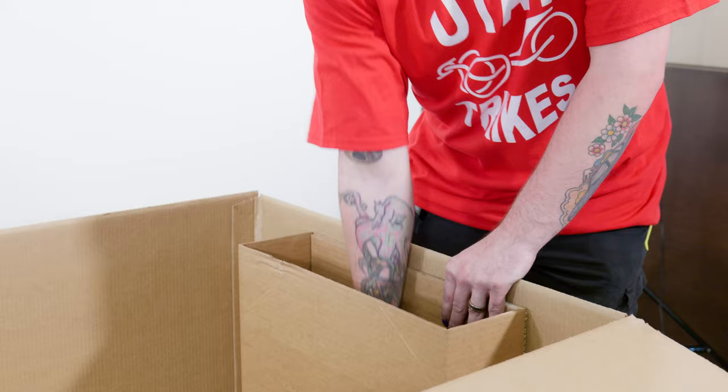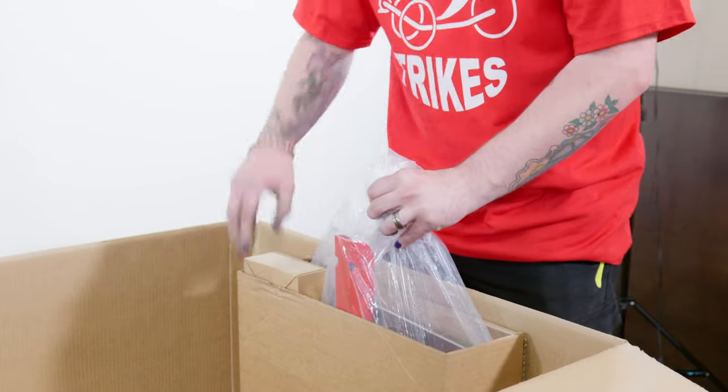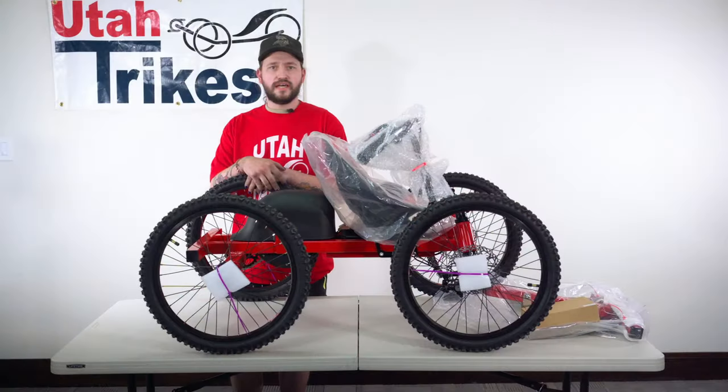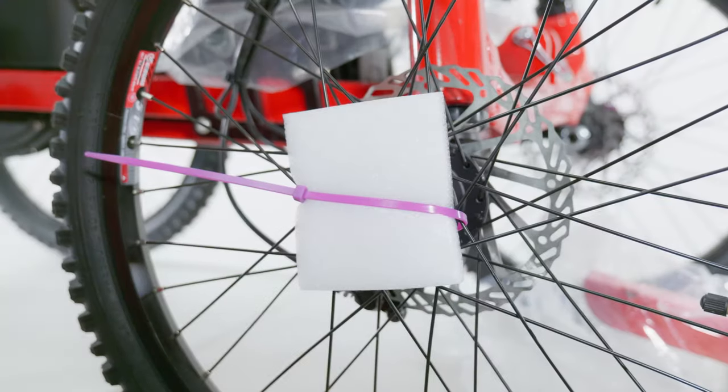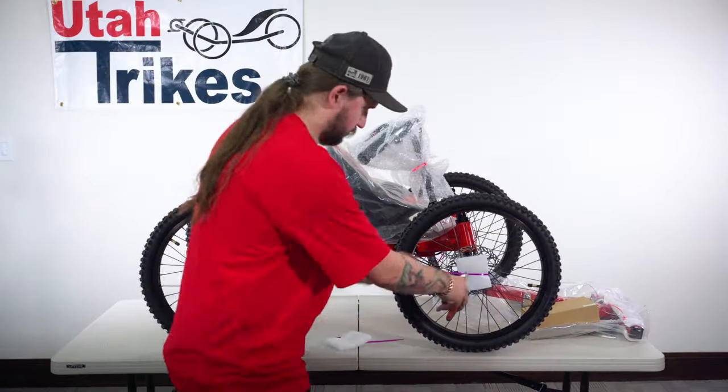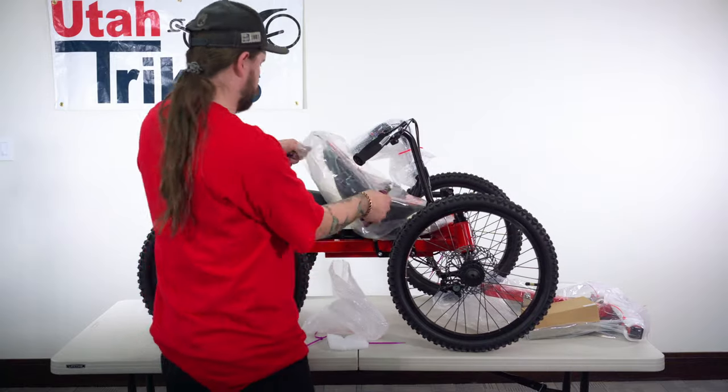Then check the cubby placed at the front of the box. Inside should be a small cardboard box containing your charger and your front bumper. Now that everything is out of the box, you will notice the colored zip ties used to hold on the packaging. Only cut the brightly colored zip ties when removing the packaging — the black zip ties hold important wiring components to the frame of the quad.